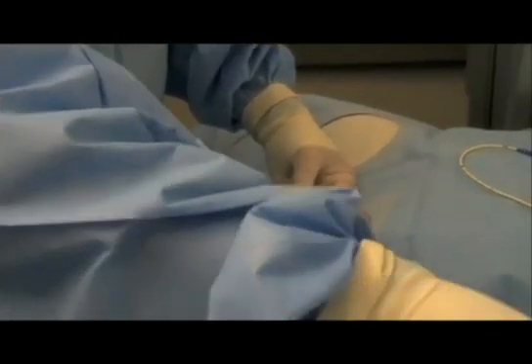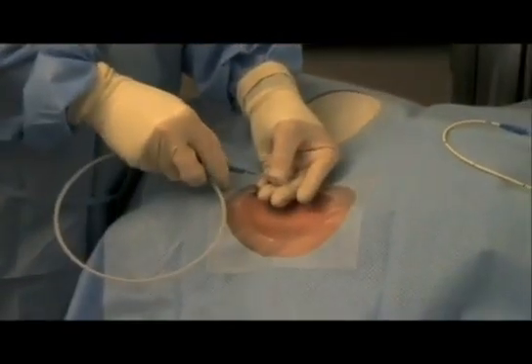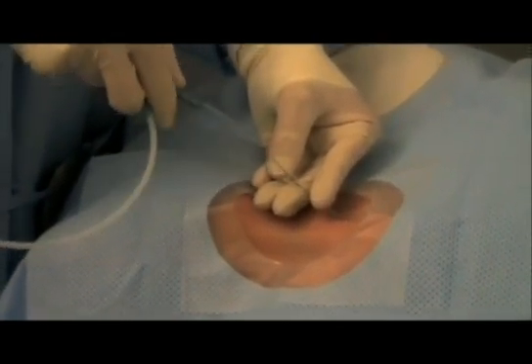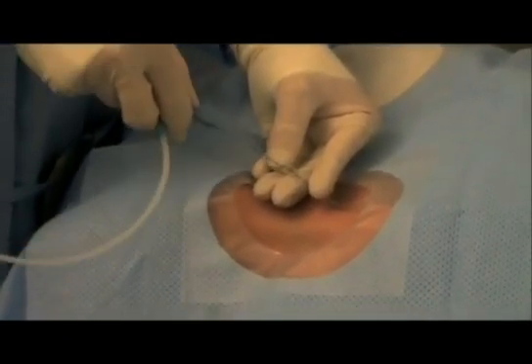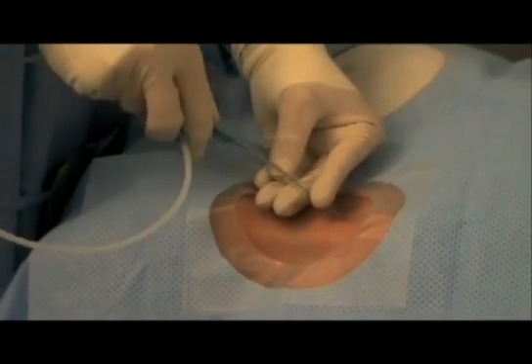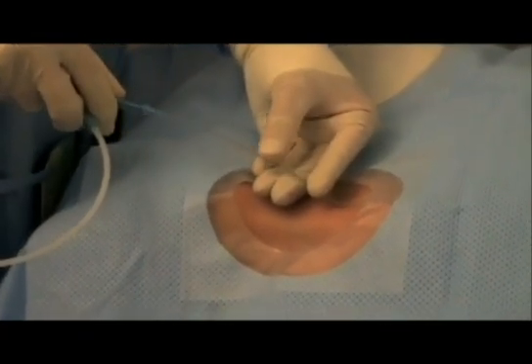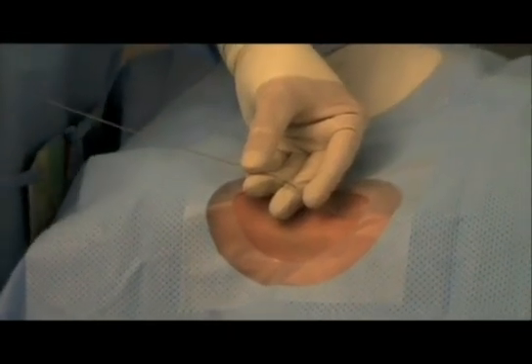Let me show you what we do here. You'll take your wire and you can thread the wire into an artery and it's not going to cause any problem. You've already made the needle stick, so hopefully it's not an artery, but if it is, the damage is already done. An 18-gauge needle is a pretty big size, but if you haven't dilated it, generally these folks do okay.